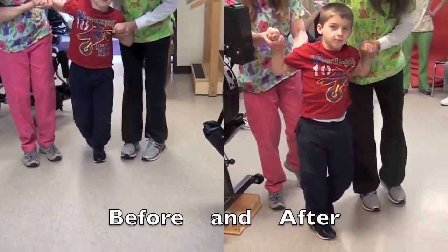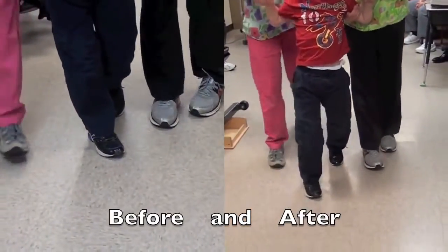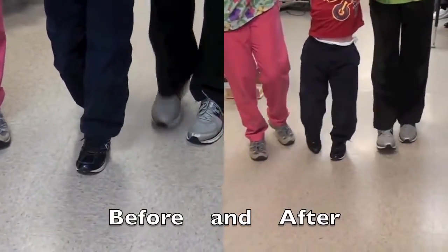I'm Melissa Hackman, the occupational therapist at Clairvue School. I'm Christy Weimer, a CODA here at Clairvue. I'm Jennifer Schmidt, physical therapist at Clairvue. One of my students walks with his feet going inward, almost like scissor steps. After he used the pediatric quadricizer, he walked straighter. I mean, it just makes me want to cry.